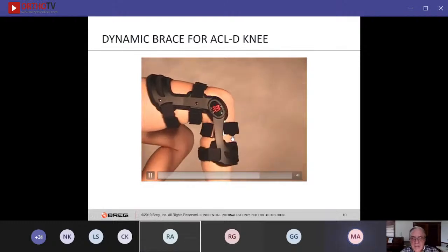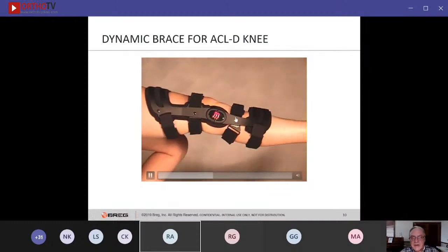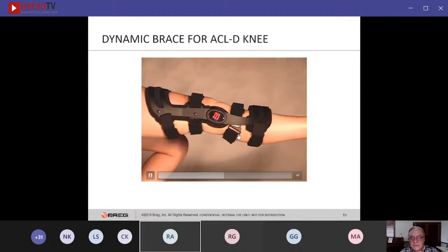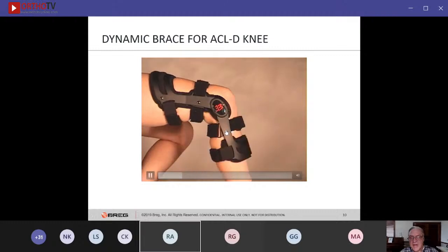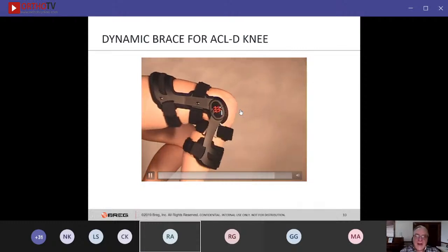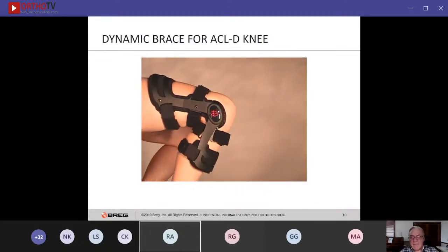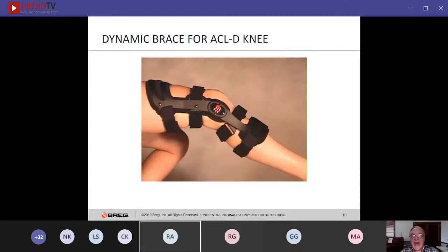Okay. So I want you to concentrate on this small silver lever that handles the proximal anterior and posterior tibial strap. They are connected to a separate lever. And notice that it's protruding anterior now, but as you move into extension, you see all the posterior movement in that proximal tibial strap. Start here, it's snug, but as you get into extension, it's much higher. That additional lever actually moves that proximal anterior tibial strap 12 to 15 millimeters. That's quite a bit. And that is the additional load that you get from a dynamic brace that you don't get from a static one.